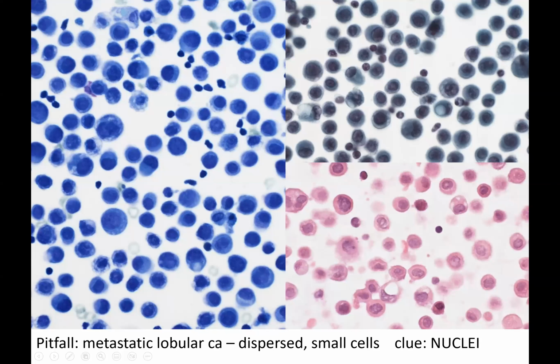Another potential pitfall in metastatic breast carcinoma is when the cells don't present in cannonball clusters, but as singly dispersed cells. These can be easily overlooked as a population of just reactive mesothelial cells. However, the clue is in the nucleus. There's actually a high nuclear to cytoplasmic ratio, and the nuclei are abnormal with nucleoli and irregular coarse chromatin.